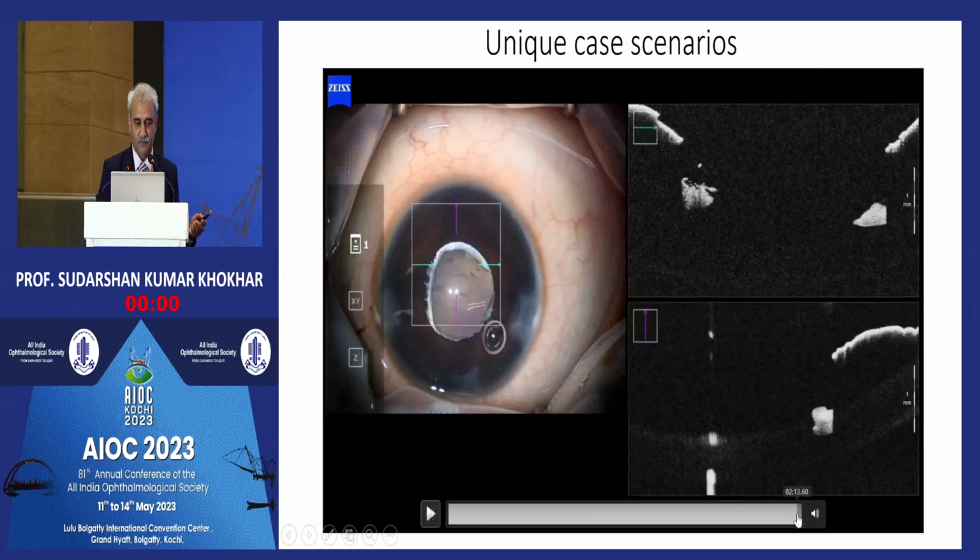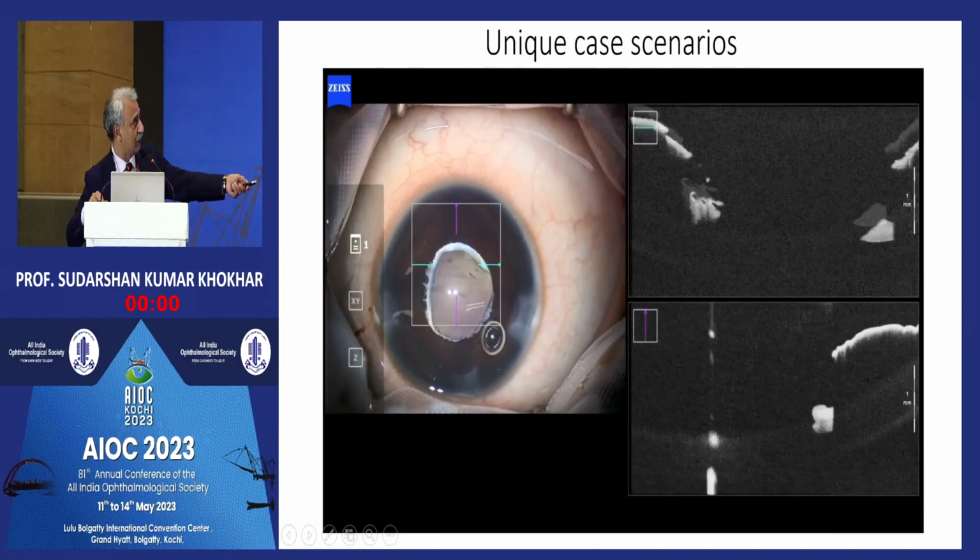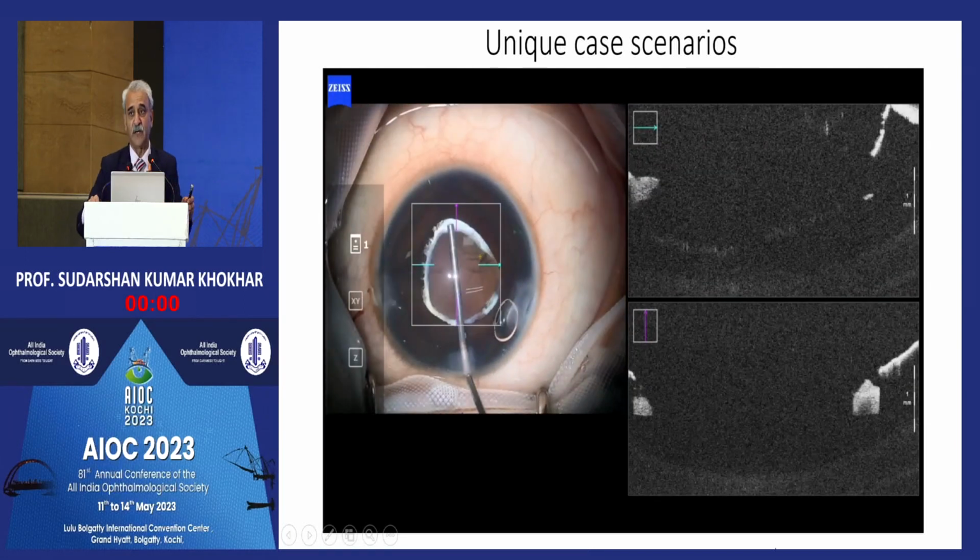No, I'm just done. All right, so here also you can see the multiple modality. You can see the thickness of the thing at the back. And once you cut it, it actually gives you a real-time thickness OCT, and tells you that you can use whatever technique you want. You can use a cutter, or you can use a diathermy in this patient in case you have blood vessels on the top, and you can get away. And if it's a softer one, you can just aspirate it, or you can polish it off with your bimanual cannula itself. Right. Thank you.